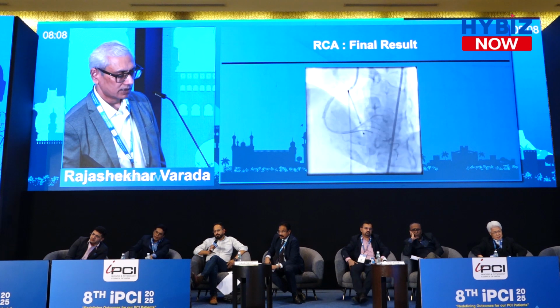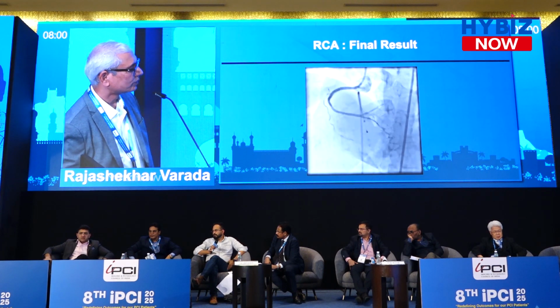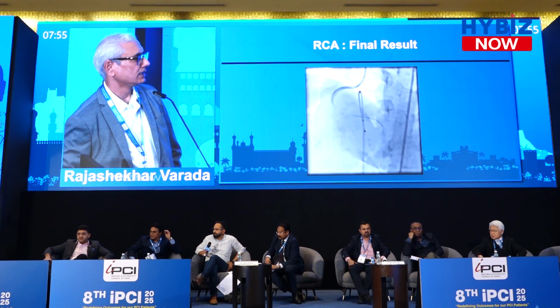Everybody agrees. So most importantly, whatever tools you are using has been imaged and it's fine. The most important message is that whatever tools you are using to modify calcium, the MSA should be good and appropriate for the vessel. Yes. So whatever works best is the best.